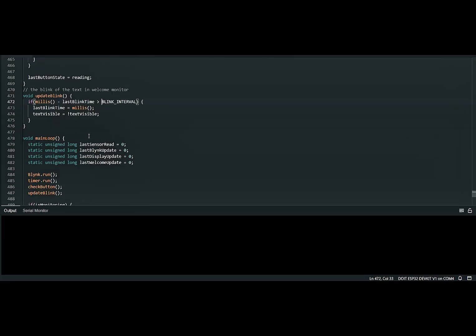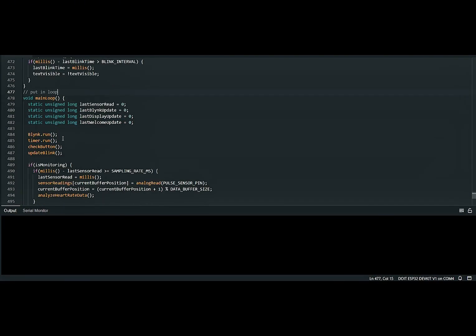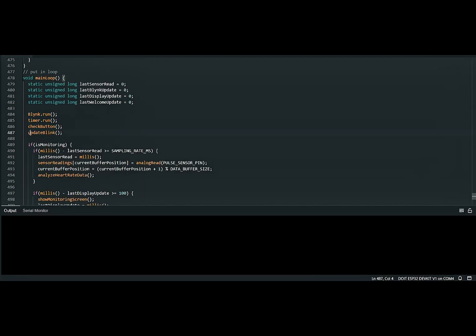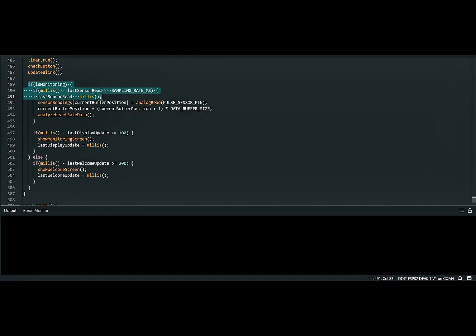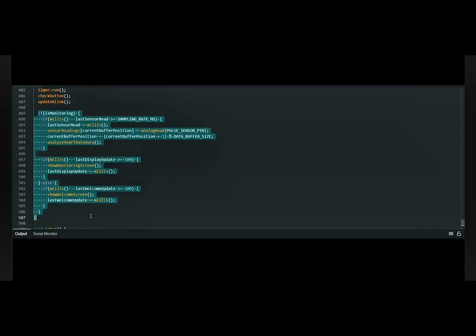Next is void main loop. So it will mainly be in the loop. I will use it in the void loop. So it will declare some variables and the blink timer to run, void check button that updates blink to always run for the blinking text, and some variables that need to always run behind for the BPM and stress calibration and calculation.